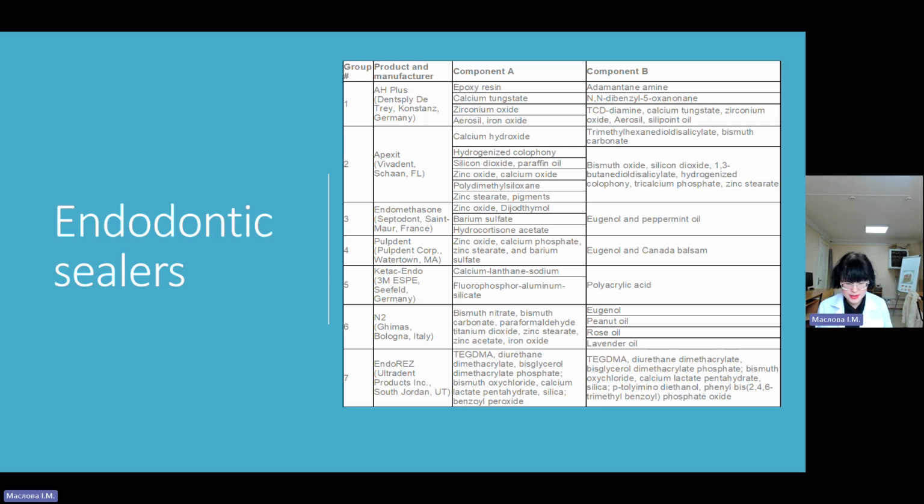It was claimed that the adhesion to dentine would cause treated teeth to be strengthened.